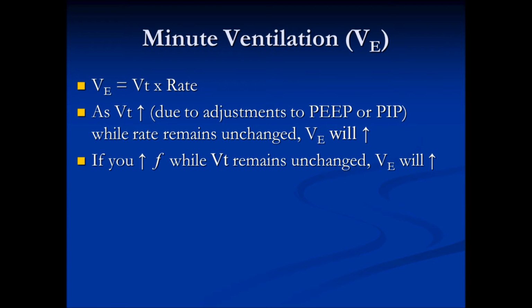Okay, nothing new here with minute ventilation. Minute ventilation is simply the tidal volume times your respiratory rate. And as tidal volume increases due to adjustments in either your PEEP or your PIP, but you have not made any other changes, minute ventilation will increase.